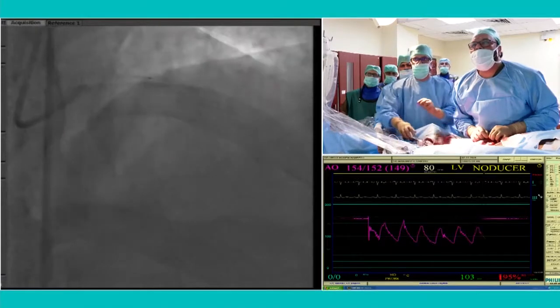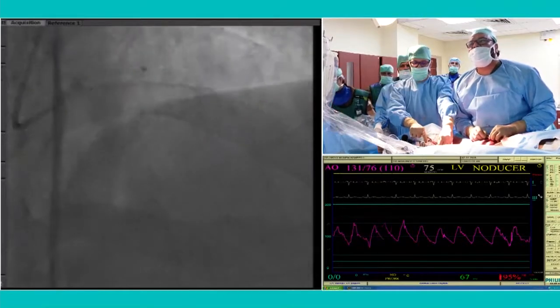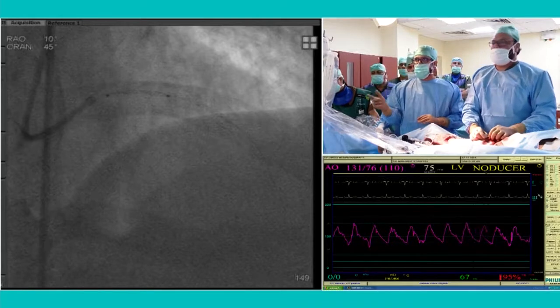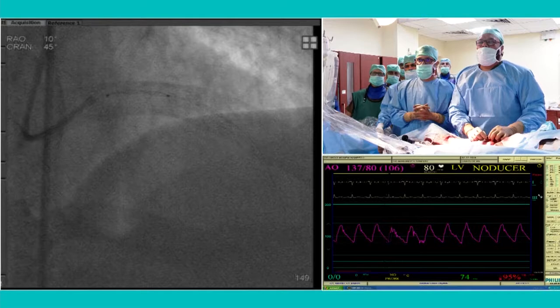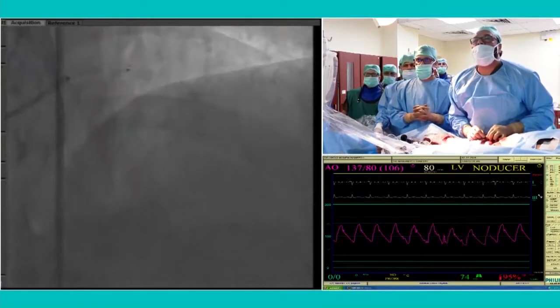I think we are too much into the LAD. A little longer would be ideal, I think. We'll just see. We'll change it. Otherwise, we have a 23 millimeter also. We'll just have a boost and see. We are too much in the LAD. Okay.